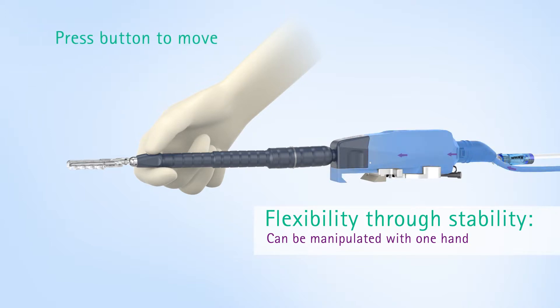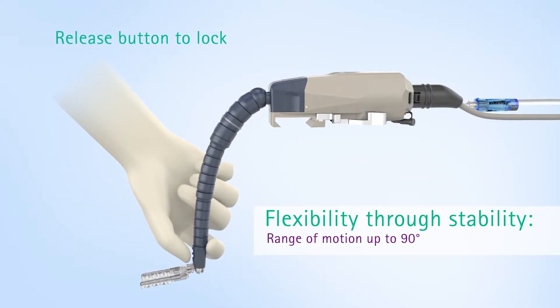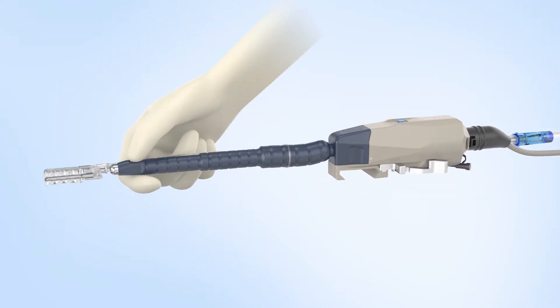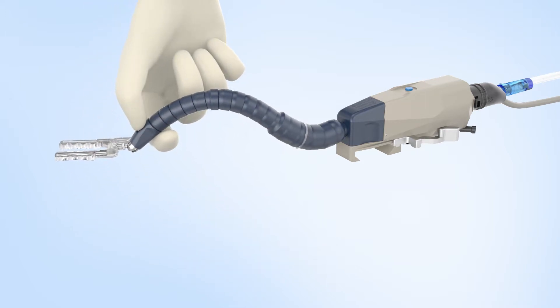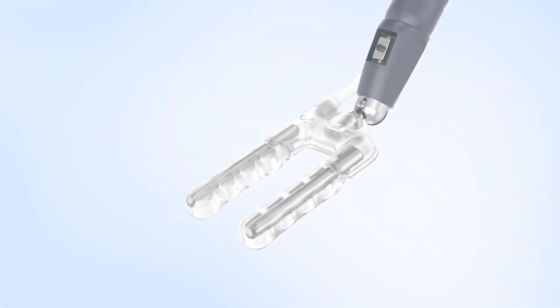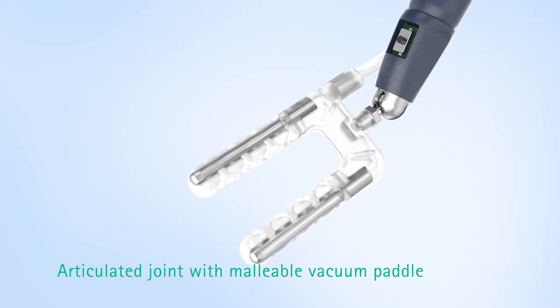Pressing the button allows the compressed air to flow into the device and the arm remains flexible. Releasing the button locks the arm in position. The FlexHeart Tissue Stabilizer allows even difficult positions to be reached easily and maintained throughout the surgery, because the device automatically relocks, providing continuous stability throughout the whole procedure.